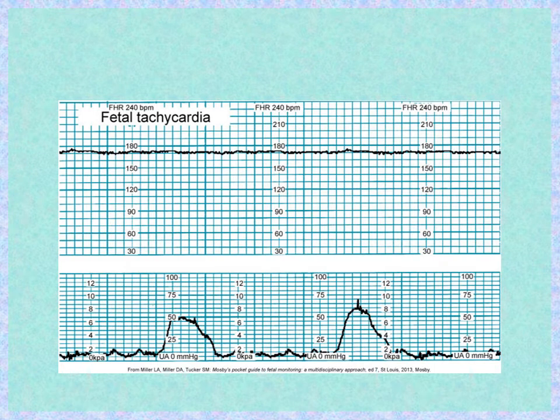This slide shows fetal tachycardia. The fetal heart rate is greater than 160 beats per minute. Where this pointer is going is 160, and you can see the fetal heart rate is well above that 160. This case is running about 170.